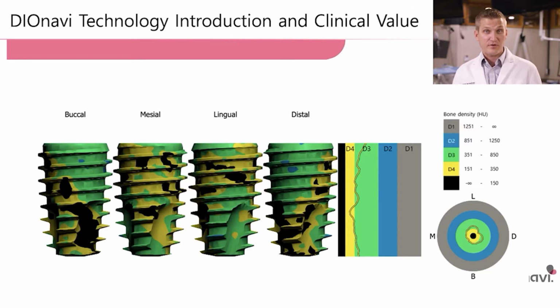So through a Hounsfield unit measurement in the software, we can go before surgery even happens and make some clinical plans based on what the bone density is going to be like. I appreciate that extra boost of confidence to understand what the situation is going to look like clinically. As you know, bone quality makes such a difference in our implant cases when we talk about loading, primary stability. This takes a little bit of the mystique off of that analysis of what it is going to be like.